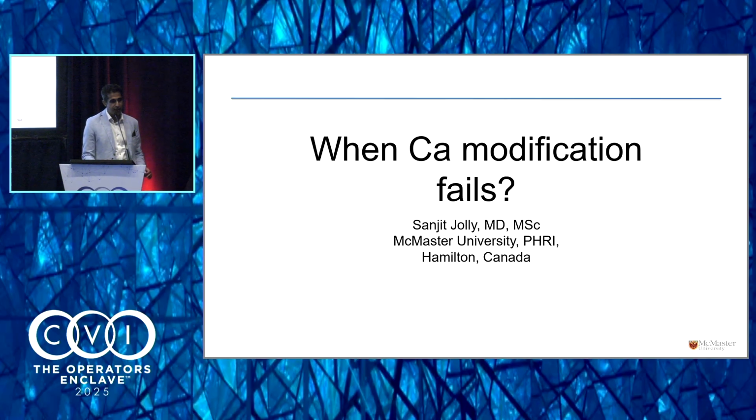I think the important thing is you need to be prepared. And I think the most important thing is every time I inflate an OPN NC or an oversized NC, I will take a puff, a little injection, and as soon as I see the perforation, I inflate. And then once you've inflated, you stop the bleeding. You can do your ping pong guide. We've had the Ringer balloon in Canada for a number of years, a fantastic device in terms of perfusion and stopping the bleeding, ping pong guide, and covered stent.